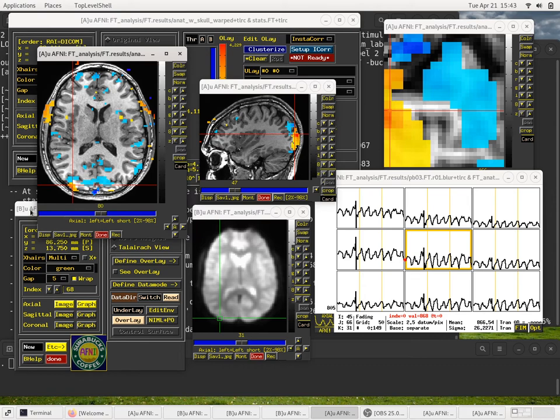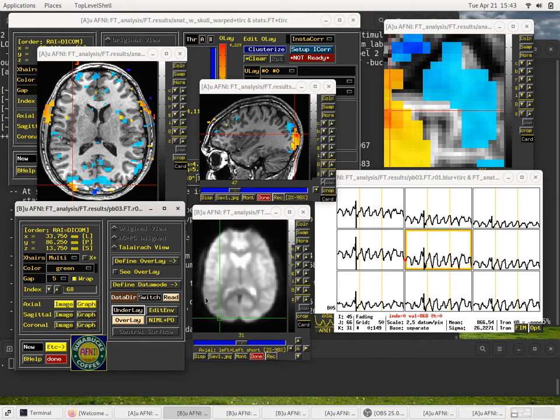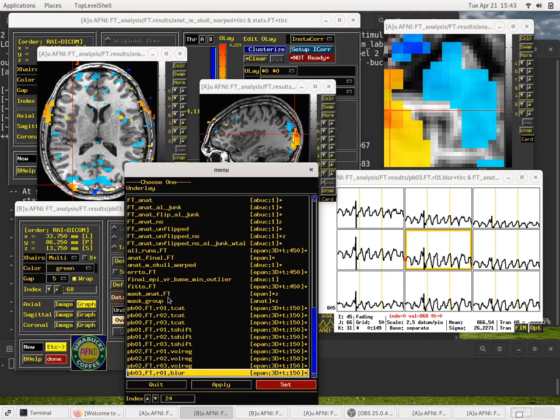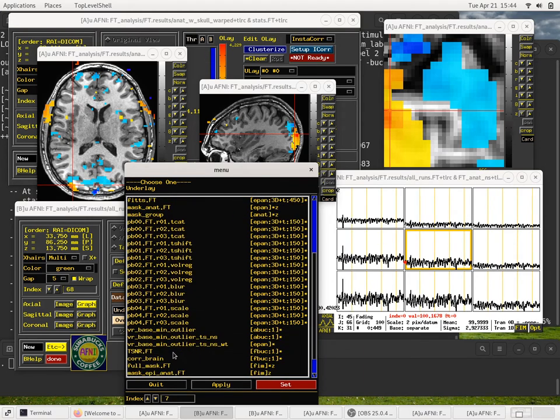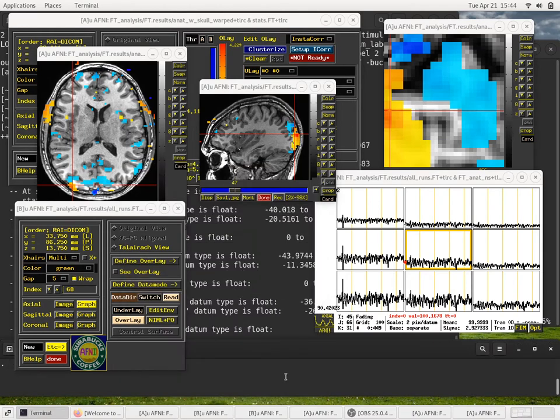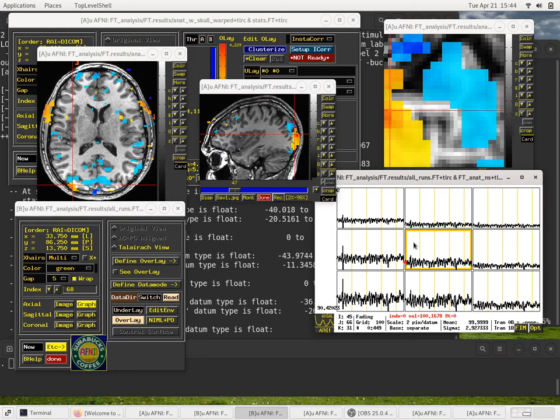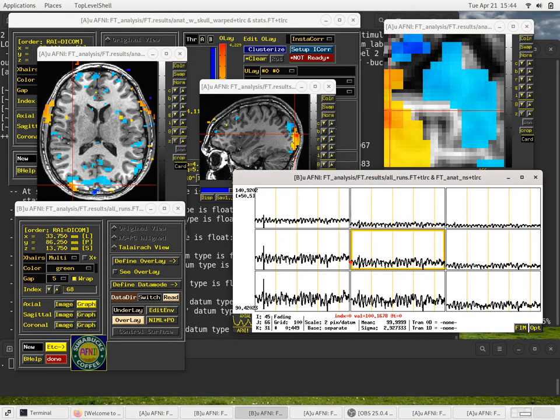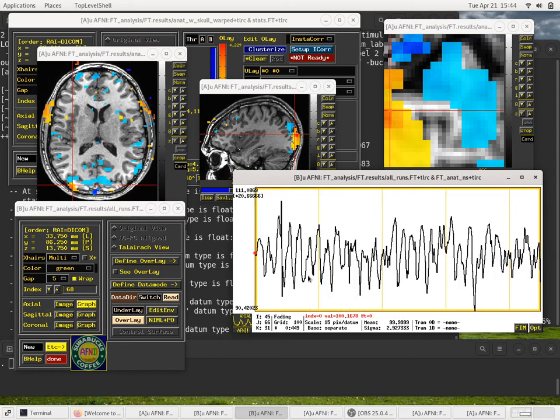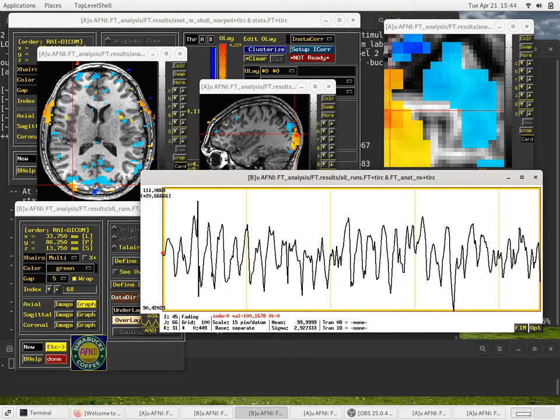If you notice the time series here, the first two bumps are fairly small. The next three bumps are pretty big. That's what we're looking for. We're at a voxel where V minus A is big or significant. The V beta weight must be 2.8 greater than the odd beta weight. So these visual responses are much bigger than the initial two auditory responses. Just to see it, that goes across all three runs. I'll move these up a little bit. In the bottom controller, let's switch the underlay from just a single run. I'll actually close this window because I'm going to make the graph wider. Let's change the underlay to be all runs, allruns.ft. That's simply the three scale data sets concatenated. The AFNIPROC script created that itself. Maybe we're not at a great voxel here because we've got a spike in the data. Let me hit a couple lowercase m's and we'll focus on the central voxel.